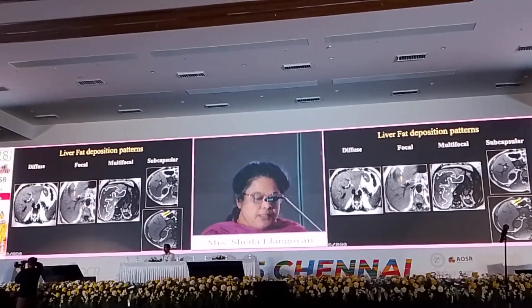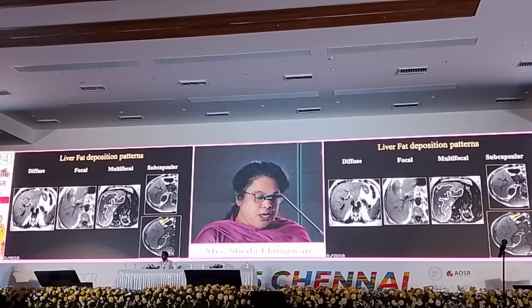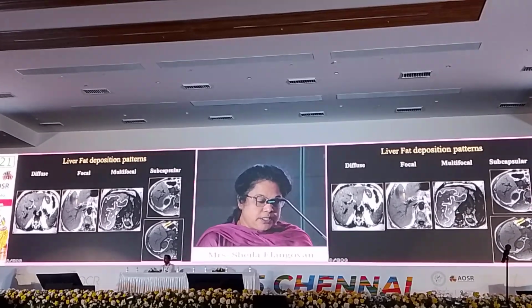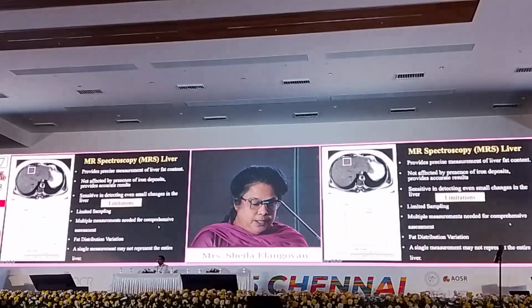And here, this is a T1 weighted in-phase image, and this is a T1 weighted opposed-phase image, wherein you see signal loss in two subcapsular lesions, that is, just below the capsule.